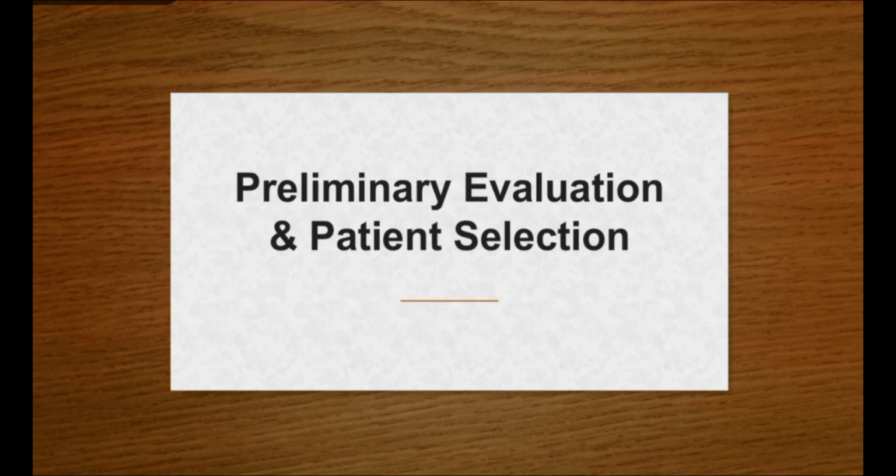Okay, so over here in patient selection you have to see whether there is any disease. The most important thing is that you have to see whether the eyes of the patient are in good condition or not. If the eyes are not in good condition, if there is any kind of conjunctivitis, keratitis, corneal ulcers, or any other complication, external eye diseases, or some ocular diseases, in that case you should not prescribe contact lens to the patient. In that case glasses are the good choice, right? So here you want to see whether he is a good candidate or not. First of all, you have to do the patient selection regarding contact lens wear.